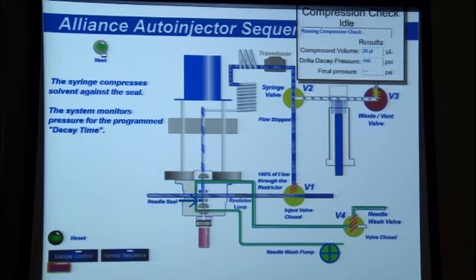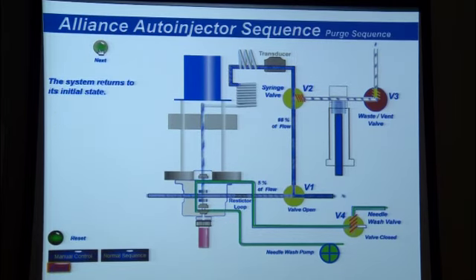It will then drive the syringe up to the pressure limit, stop, and wait for the decay. Here it is, the pressure is dropping down, and the final pressure of 80 psi, well, 78 psi. It passes the test. When it's done, the machine returns to its initial state. Now that we've seen how this is done, let me show you how to interpret the results.